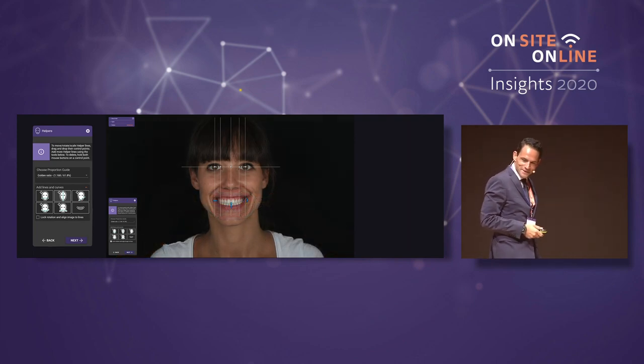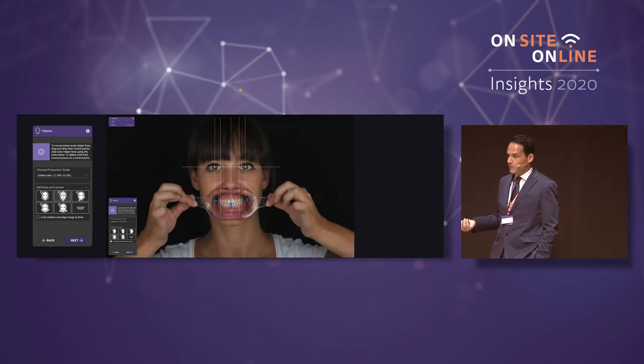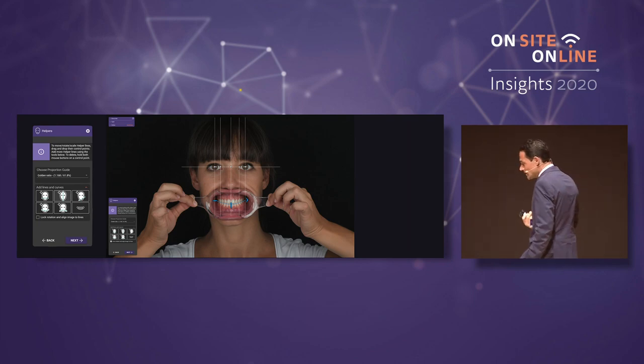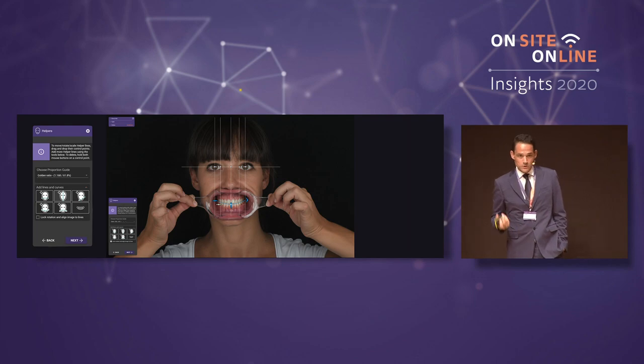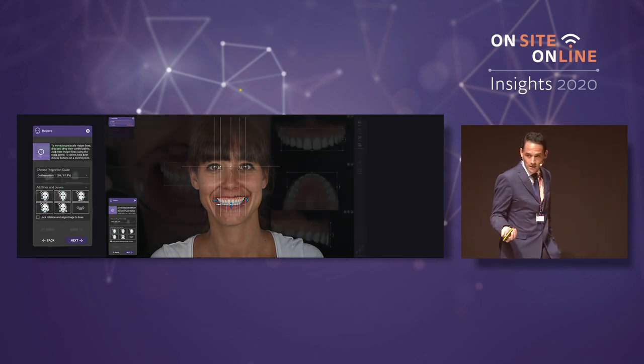It's English. So the planification is already done. I don't need any more. The patient is looking in front of me, and she's going to help me to decide what kind of teeth I must choose, because I'm going to be able to see the result before. I can send this result to the patient.